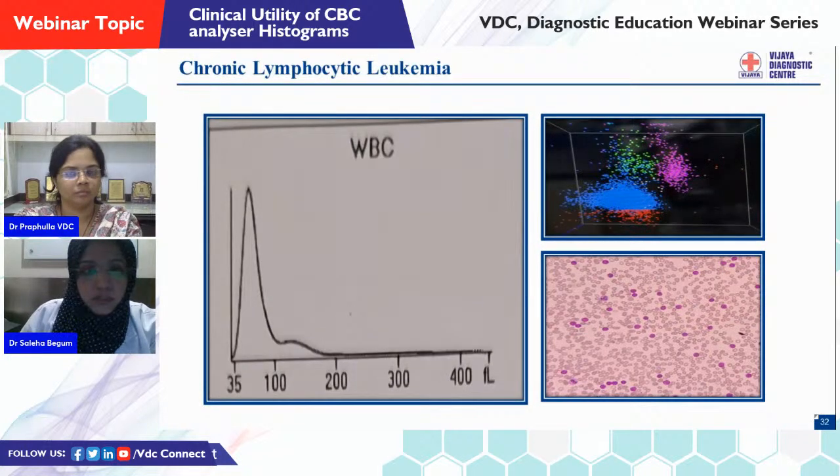So, coming to the next slide, chronic lymphocytic leukemia. Here you can see the WBC graph is showing only a single curve, not having the middle one and not having the right curve, which usually corresponds to the neutrophils. So, indicating that there is only one population present in patient blood, which is of small lymphocyte size, and there is a small bump at the end of the lymphocyte curve, which may correspond to the prolymphocytes.